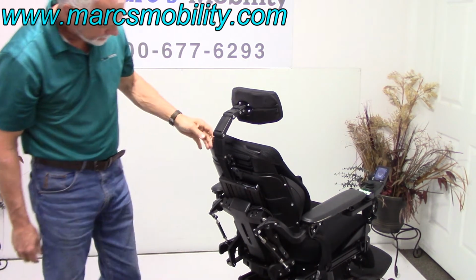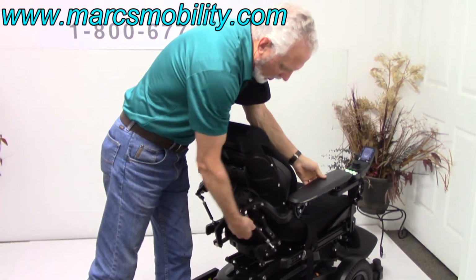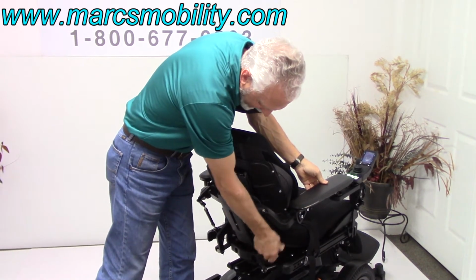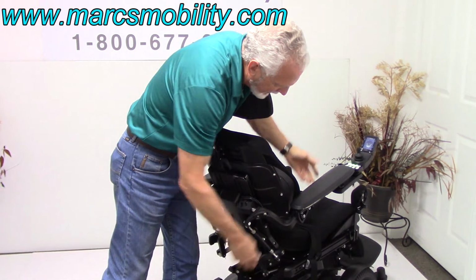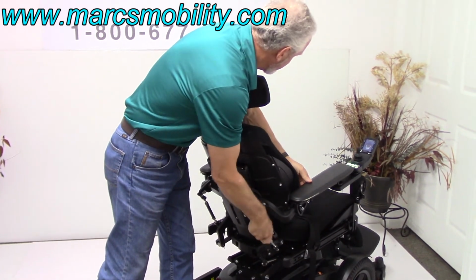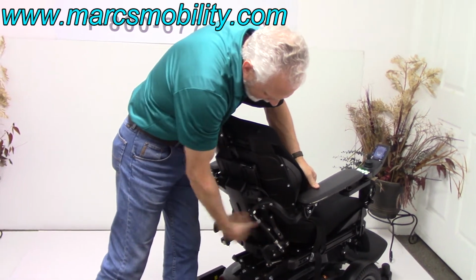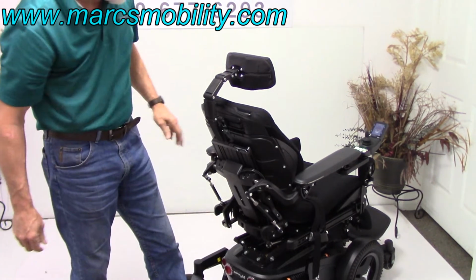Right there. These cylinders right here, they adjust the tilt on your arm. So you would have to unscrew the little silver bracket at the end of it. Then if I turn this, you can see now how I tilted it on way too much. But that's how you adjust the tilt on the arm. And then you relock it by pushing these little silver locks back to the end of it.